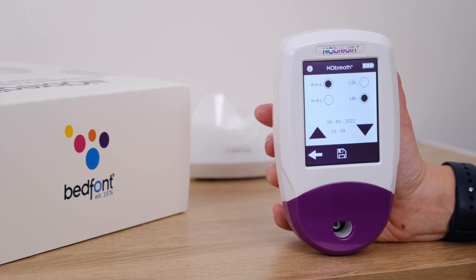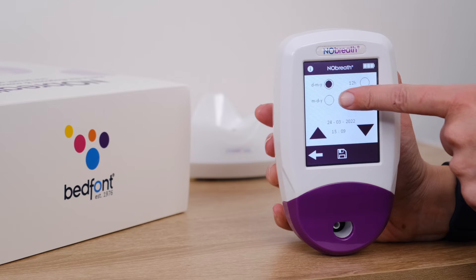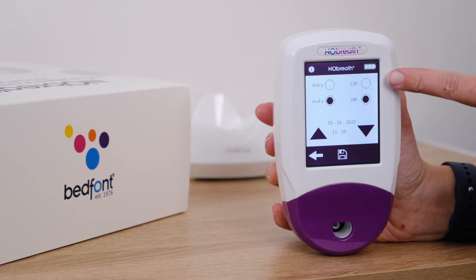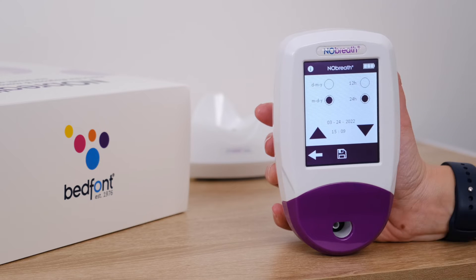Select either day, month, year or month, day, year for the date format, and either 12 hour or 24 hour for the time format. The purple circle indicates the selected option.